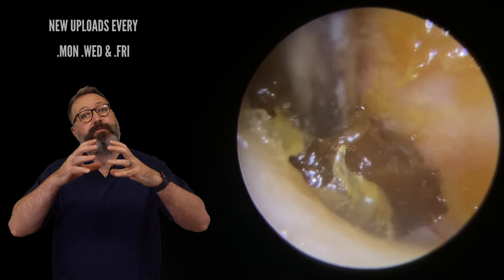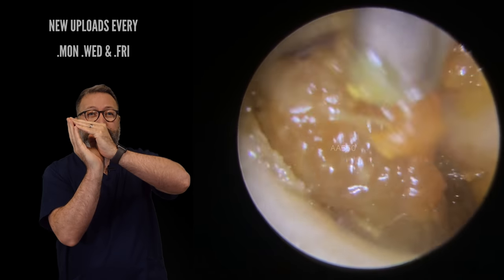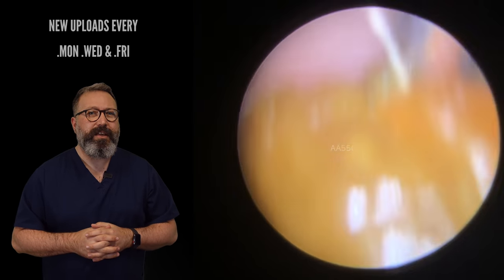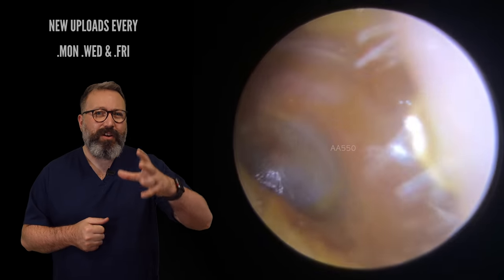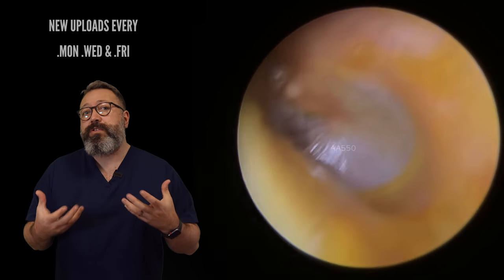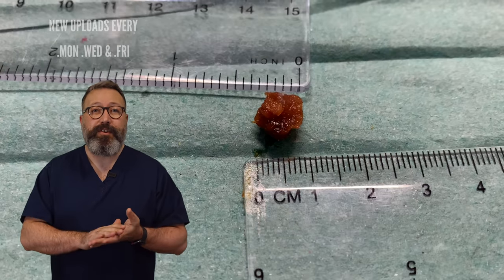You can see how the canal shape changes as well — we go from this kind of shape, it's almost twisted and become more of an oval shape. So we're just drawing this down. This is that hard bit of wax that we knew we'd encounter somewhere along the line. A lot of very soft wet wax underneath it as well. You can see that coating the canal wall — that's mostly an oil or a very, very thin wax. Now, that's what's supposed to be in the canal if you do produce wax — it's a very, very thin layer to protect it from infection.